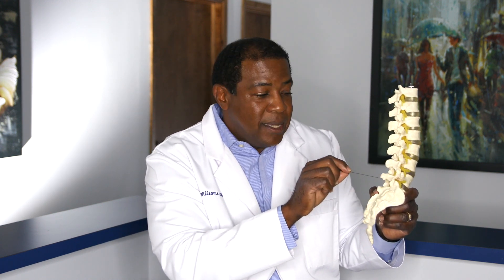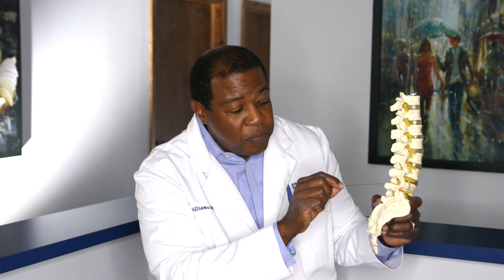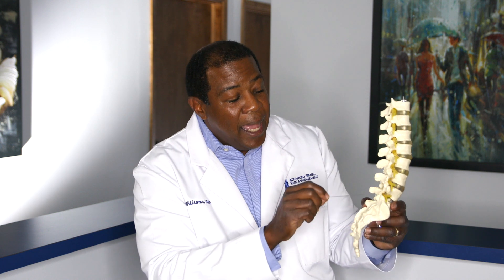I also treat the facets with local anesthetic to block the medial branch. In elderly patients with arthritic joints that are quite visible, I inject around the joint, being careful not to rupture the capsule — in most cases there's so much degeneration there isn't much of a capsule anyway. I also inject ozone outside, because ozone's anti-inflammatory and pain-relieving properties work at this level as well.